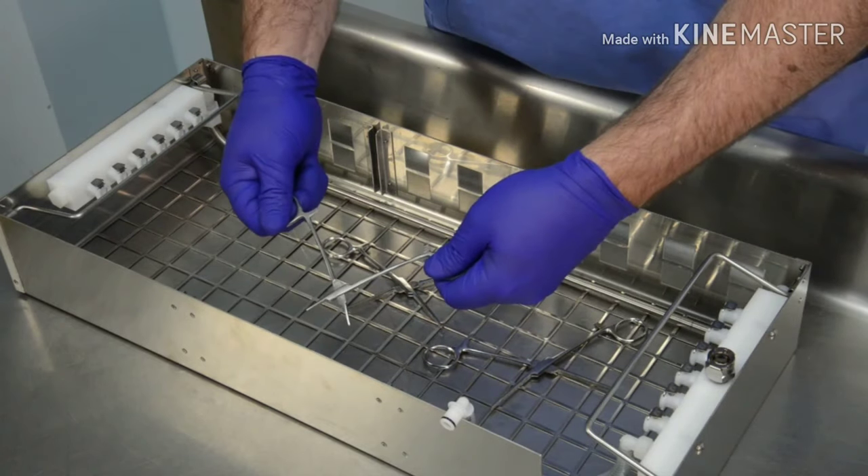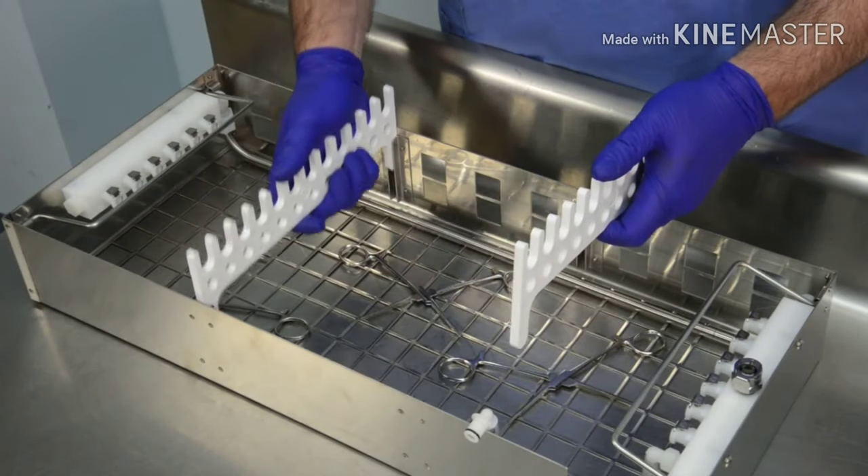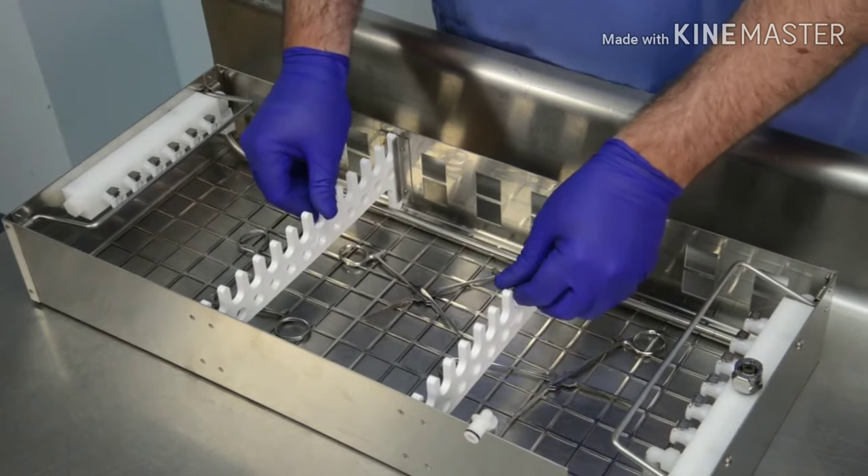After all instruments are loaded, or once the bottom of the basket is full, insert the instrument organizers. To properly flush lumen instruments, some accessories are needed.